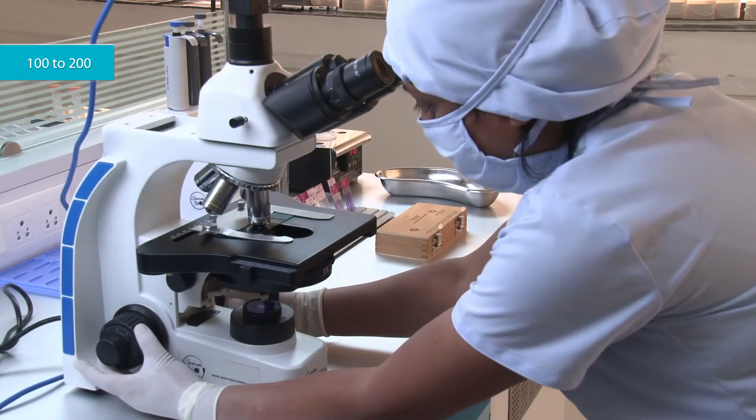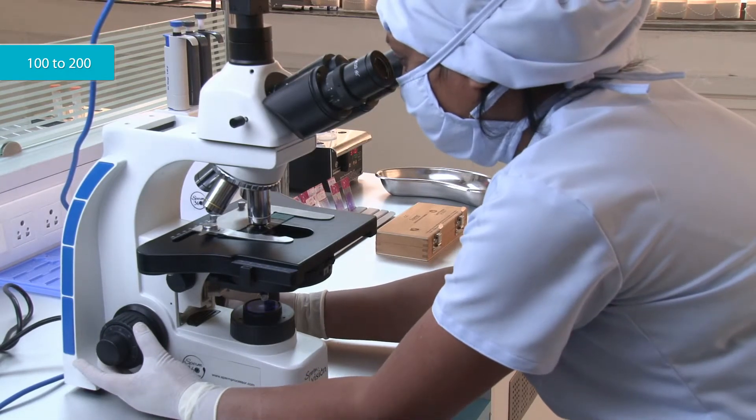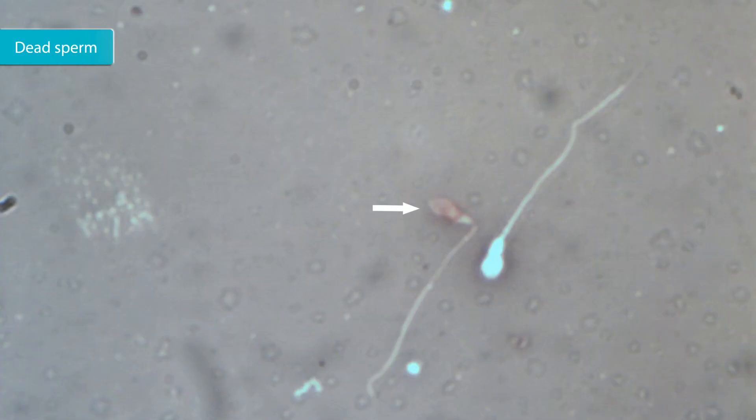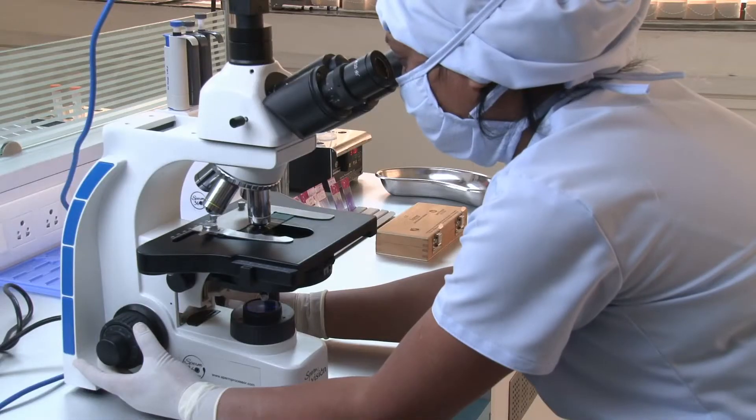Examine about 100 to 200 sperm. Unstained sperm represent live sperm. Red to dark pink sperm represent dead sperm. Calculate the percentage of live sperm.